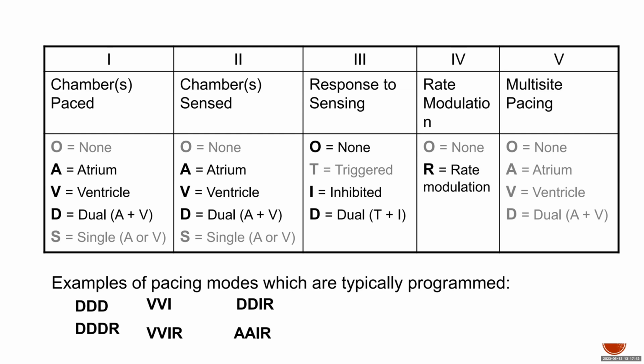Is it clear? Yes, thank you. No problem. Okay. So let me ask you guys a question to see if you truly understood this. If I tell you this patient, we program the device to VOO, what does that mean?